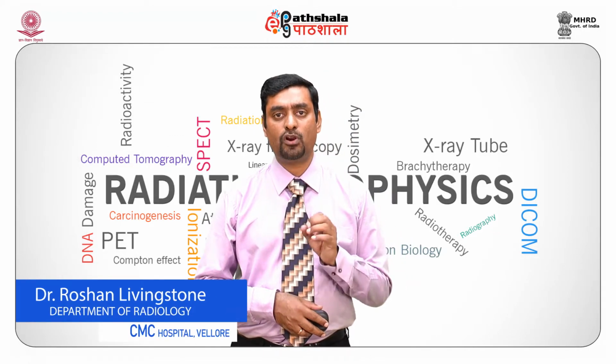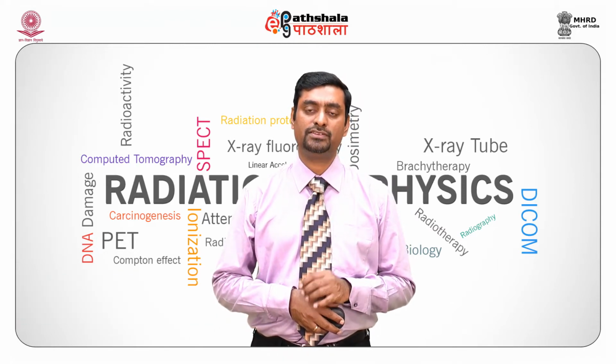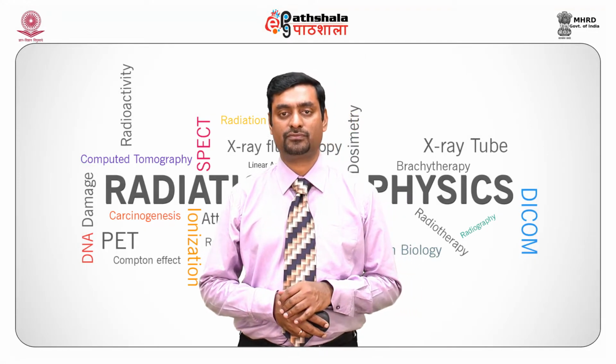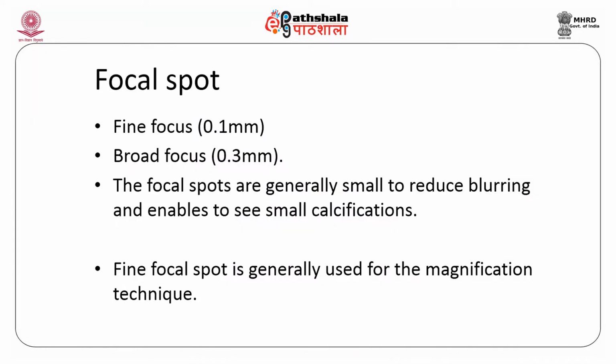Here, to have proper imaging, we need fine focus or a broad focus. Hence, the focal spot is very crucial for imaging breast tissue. The fine focus is usually 0.1 millimeter. Broad focus is 0.3 millimeter. Focal spots are generally small to reduce blurring and enable us to see small calcifications of the order of about 100 microns. Fine focus spot is generally used for magnification technique.